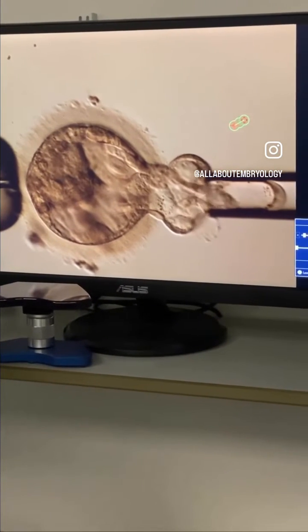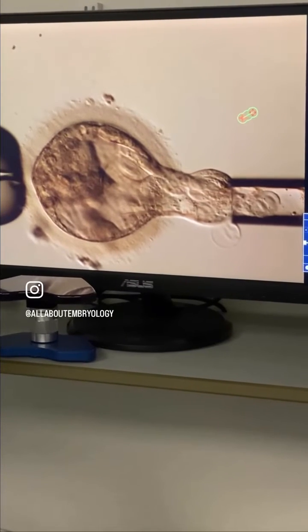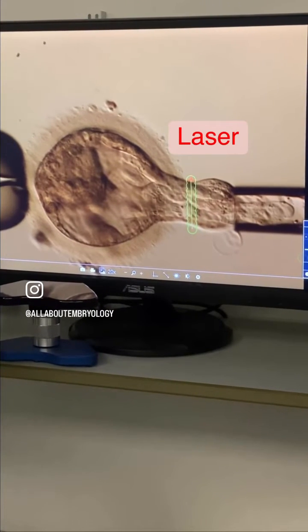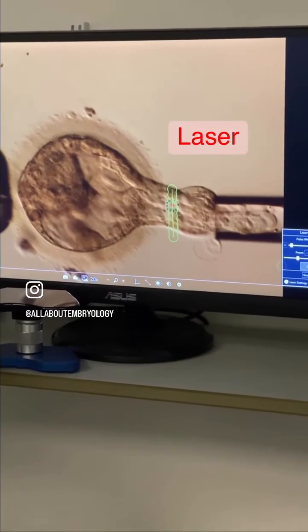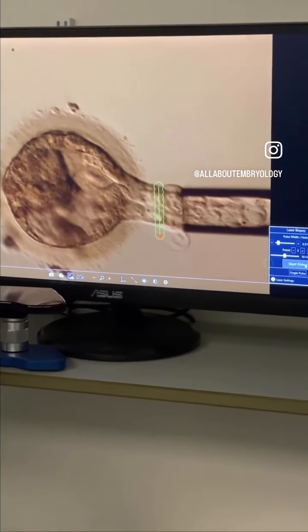Once these cells are pulled flat, using a laser the embryologist lines up and fires multiple laser shots to break the junctions between the cells. With a little extra pressure, the cells can then be pulled away from the blastocyst.